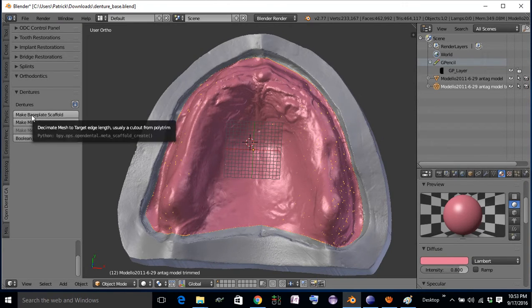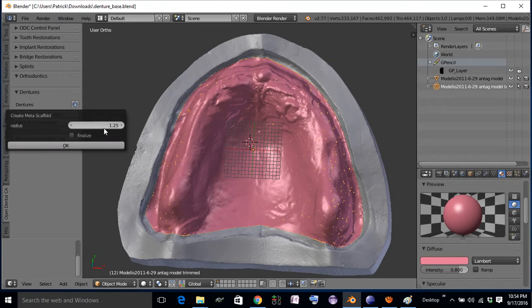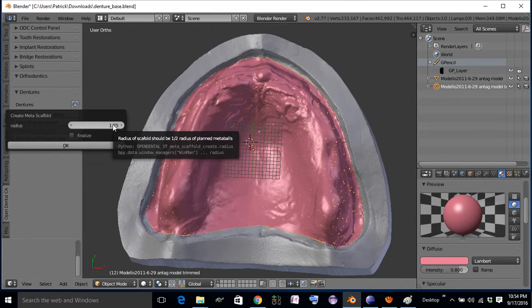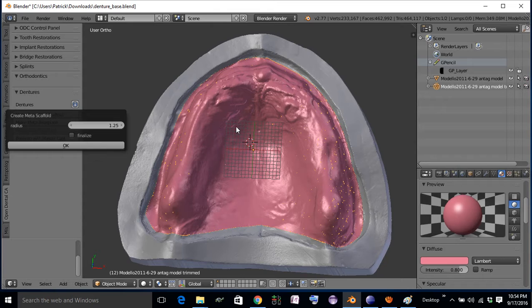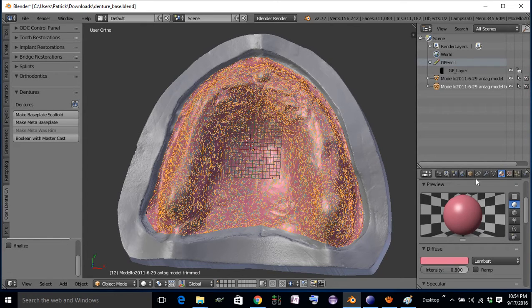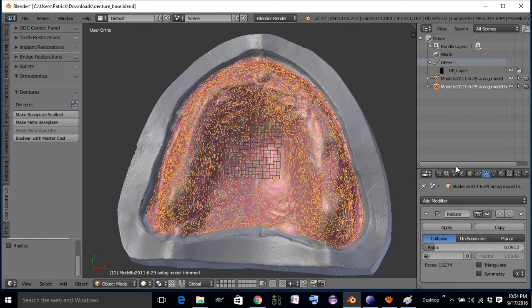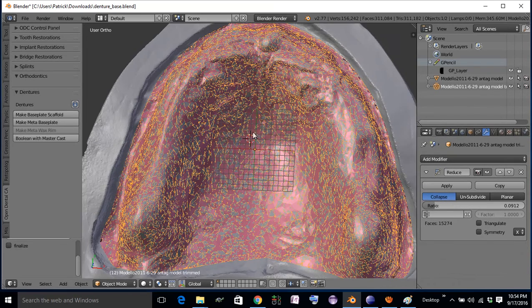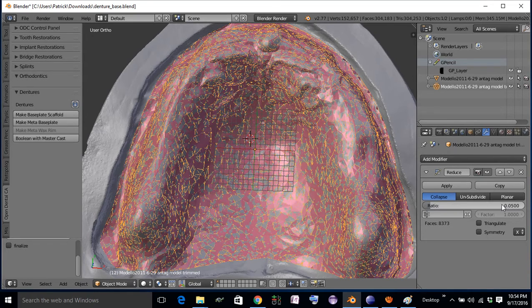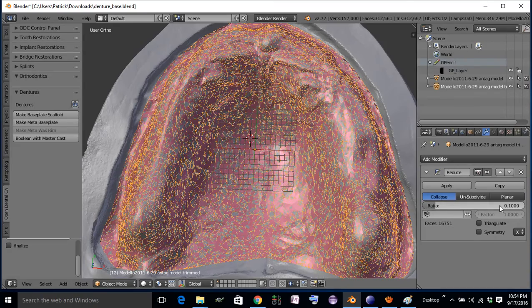Next thing we'll do is make the base plate scaffold. For the radius here, you want this to be about one half of the thickness that you plan on making your base plate. So I'm going to make my base plate 2.5 millimeters thick, so we'll make the radius about half of that. All this does is add a decimate modifier to this panel. If you didn't end up decimating enough, you could come over here and decimate more, which will make bigger points, or decimate less, which would make more tightly spaced points.